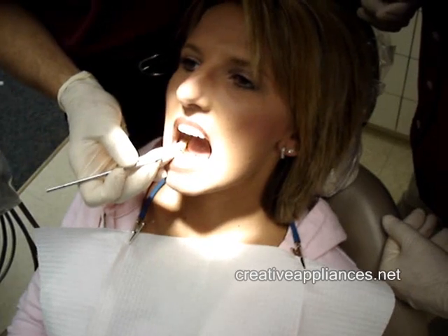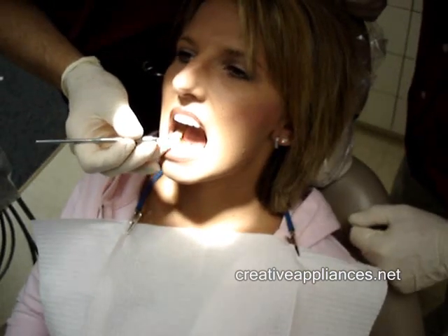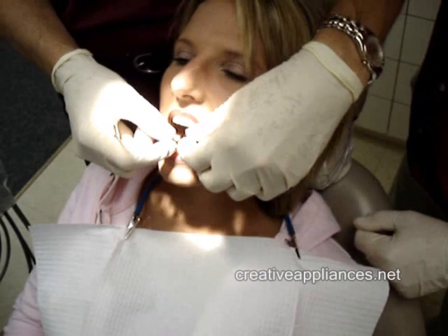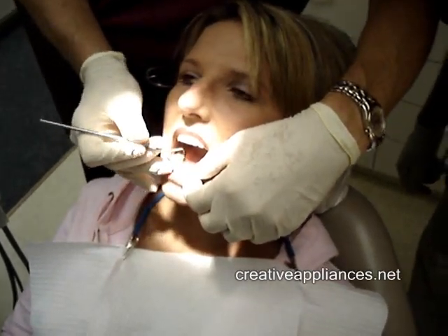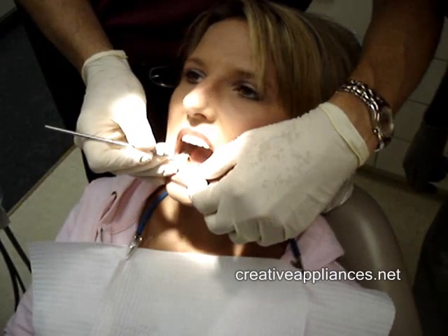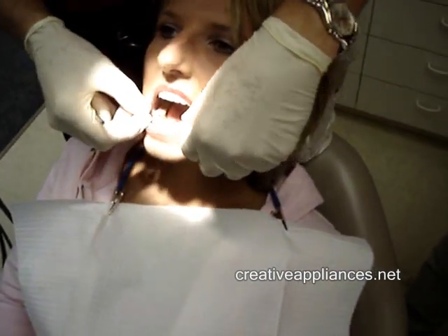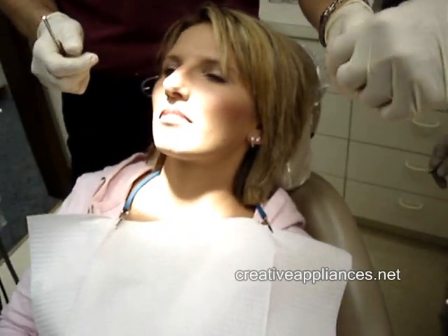I can see it with the magnifiers. Is it hitting the central or is it on the lateral? It's on the lateral. I would leave it there — it's just going to help. Now, do you want to do any bending here or do you think that little bit of room is fine? I think we should back it off a little bit. Okay, I can actually show you how to make that adjustment.